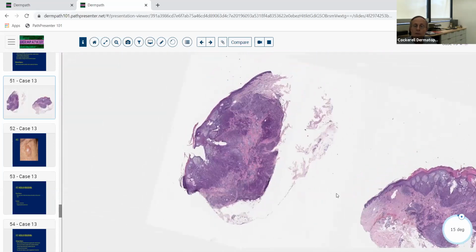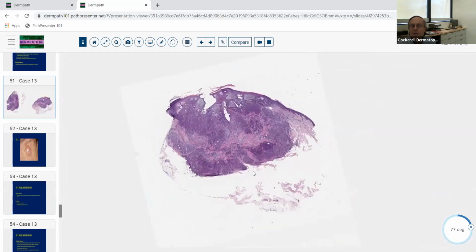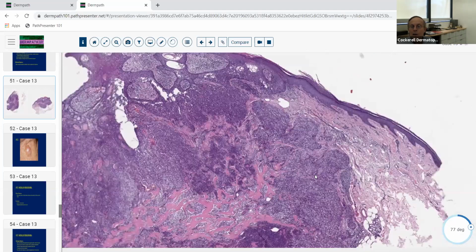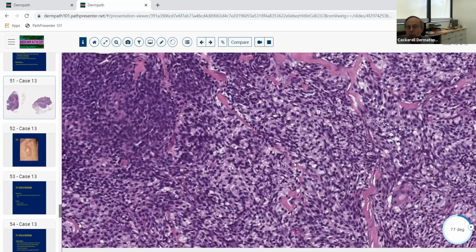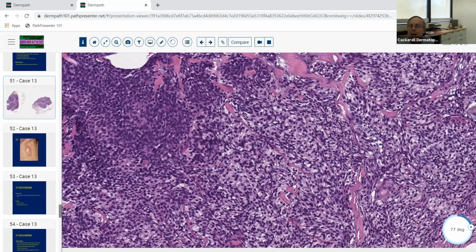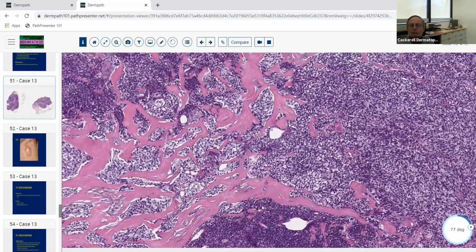And so this is another example. A lot of times you'll get these, they just kind of look like cysts, or they're kind of deep nodular lesions in the skin. So with our magnification, it looks pretty much the same on this side as it does on the other side. You got some thick pink collagen bundles associated with it. So this is an example of a nodular hydradenoma. So this is another adnexal neoplasm. This is very common to see these big, thick keloidal collagen bundles in these lesions.